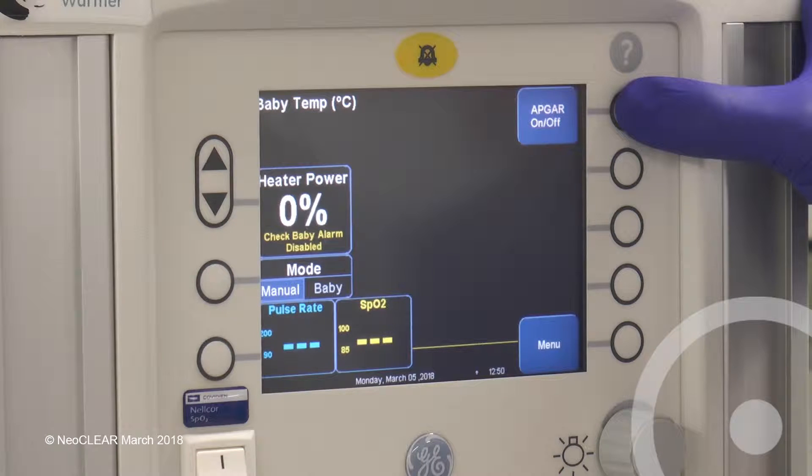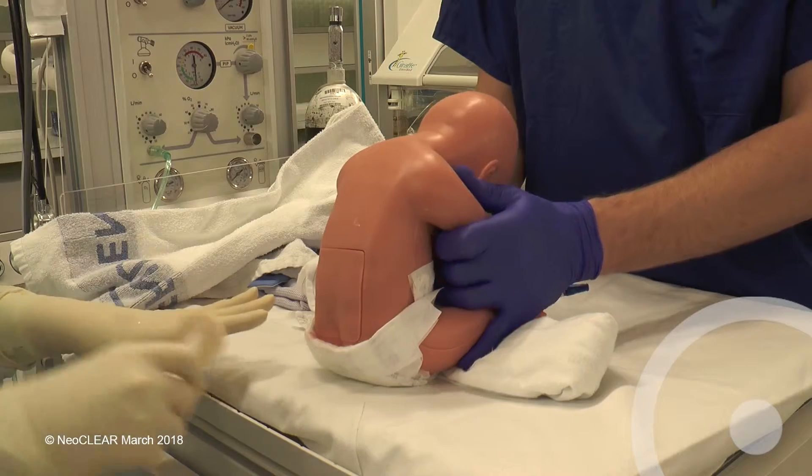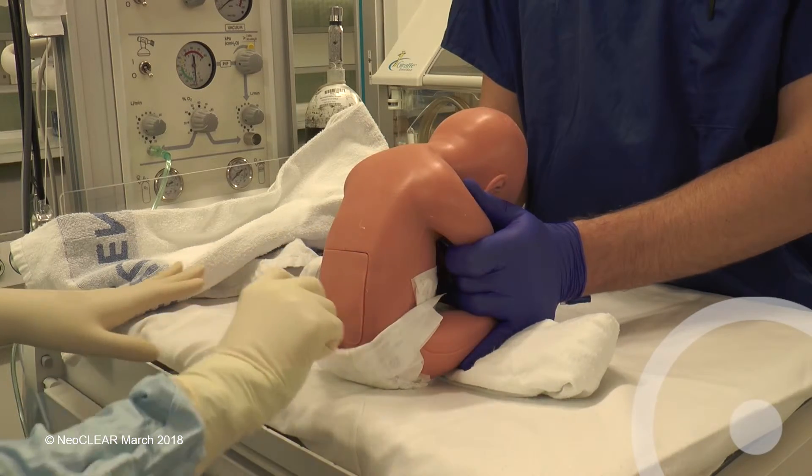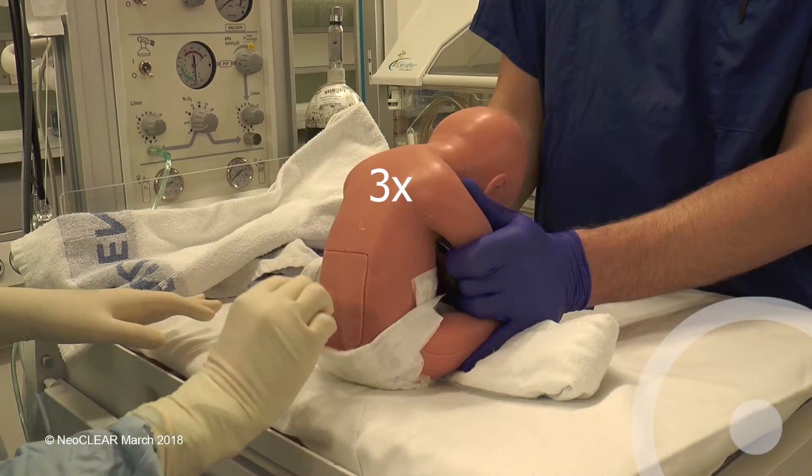The second assistant should begin timing at the start of cleaning the skin. Clean in a spiral from the lumbar region out to the iliac crests. This should be done three times and allowed to dry for 30 seconds.